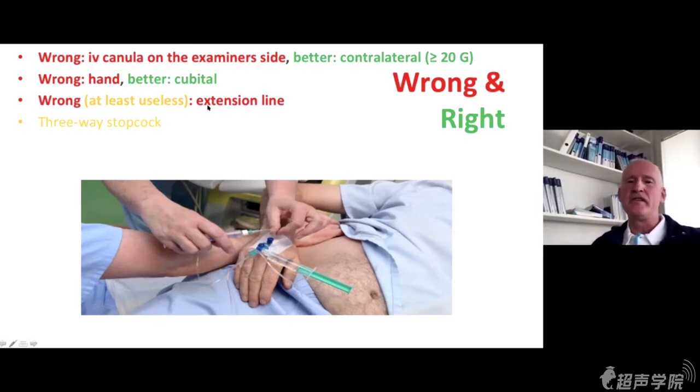Wrong, at least useless, is an extension line. Why an extension line if you could do it direct? And the 3-way stopcock is not necessary. You can do it stable in the position as shown.